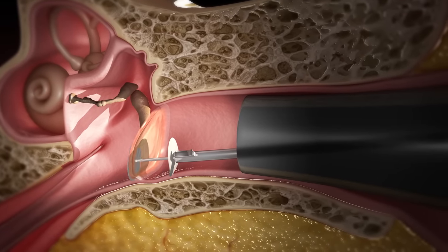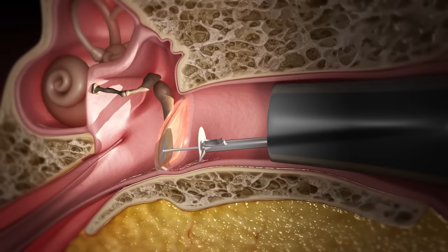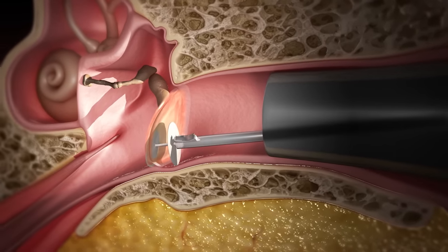By retracting the device, the surgeon positions and attaches the inner graft to overlap and cover the perforation. The external graft is then advanced and attached to the inner graft.